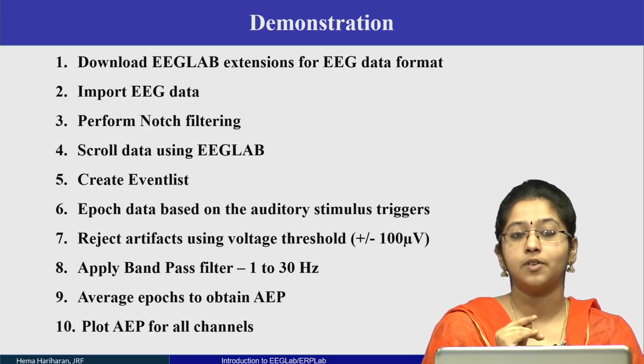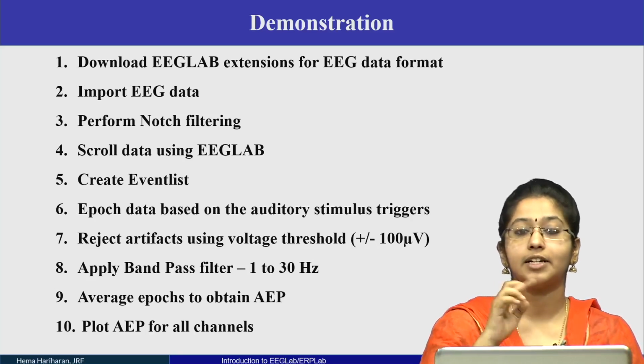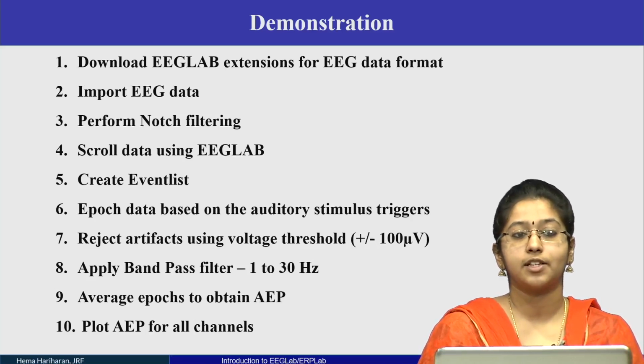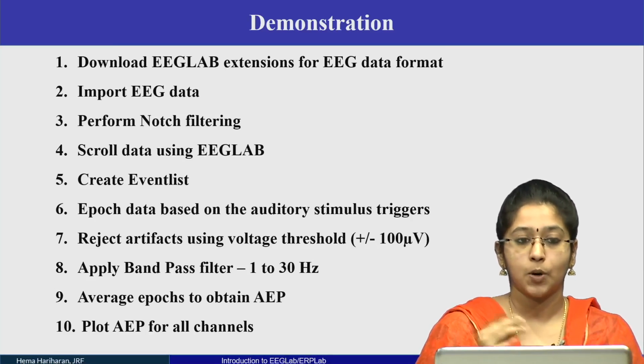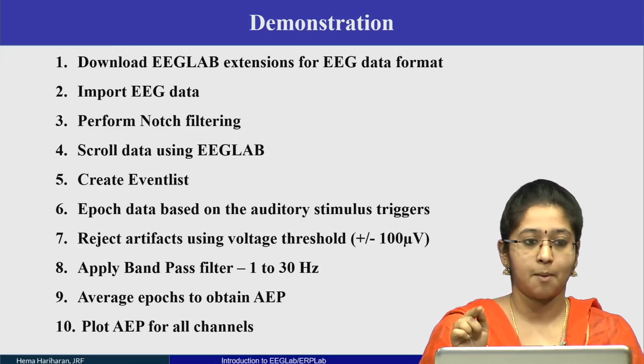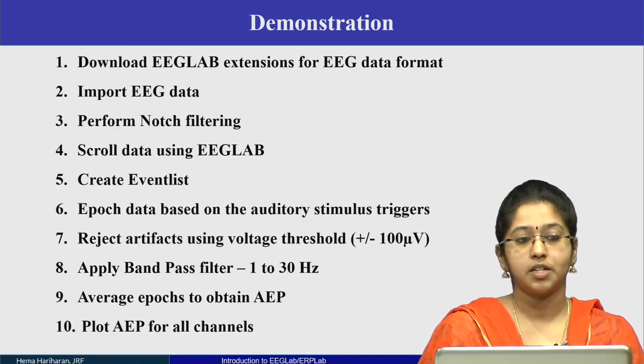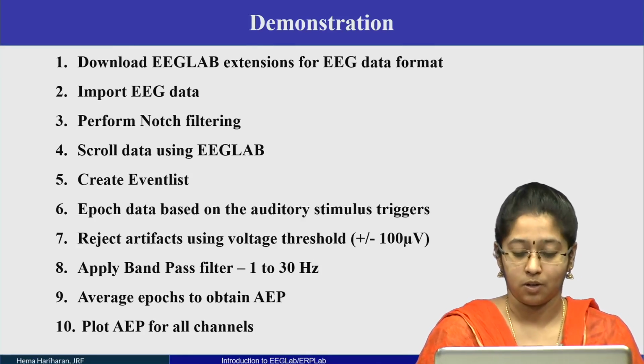Some, like the P300, will be positive up, but almost every other potential will be negative up only.